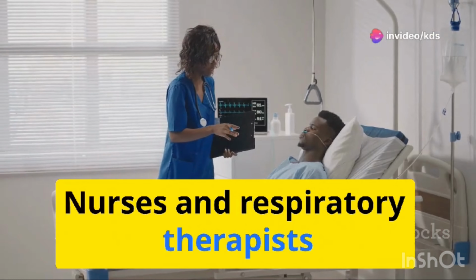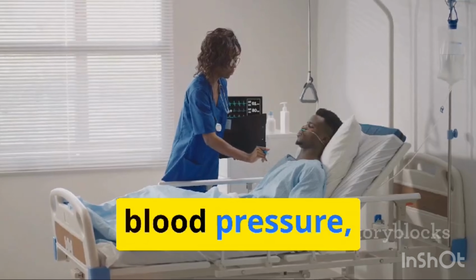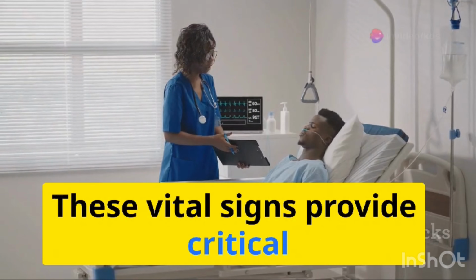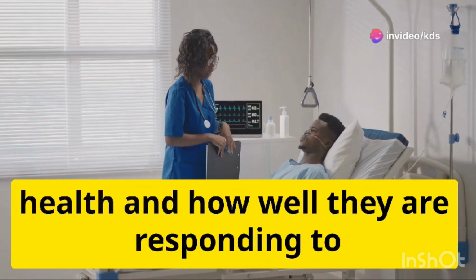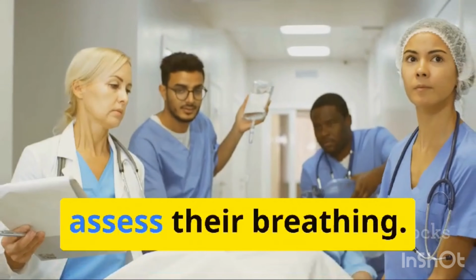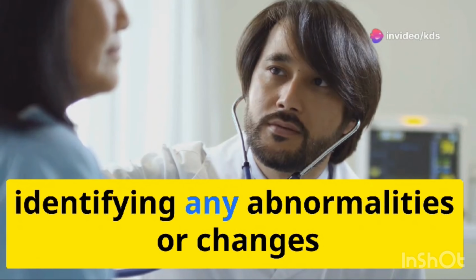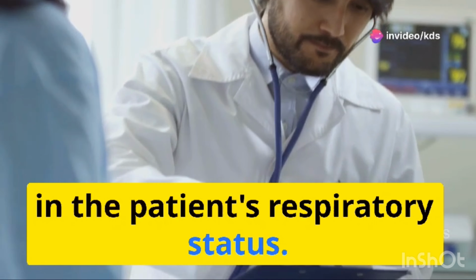Nurses and respiratory therapists regularly check the patient's vital signs, such as heart rate, blood pressure, and oxygen levels. These vital signs provide critical information about the patient's overall health and how well they are responding to the ventilator support. They also listen to the patient's lungs and observe their chest movements to assess their breathing. This hands-on assessment helps in identifying any abnormalities or changes in the patient's respiratory status.